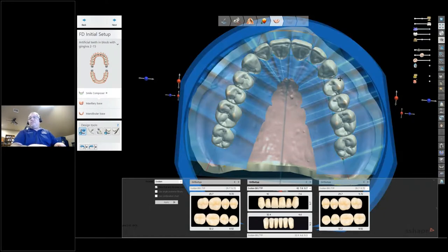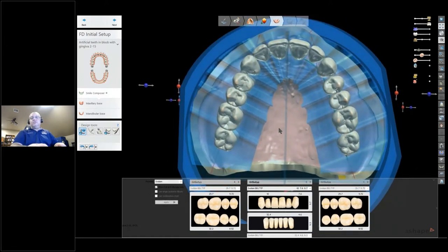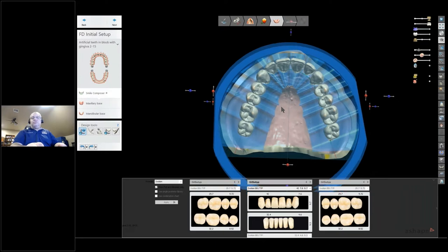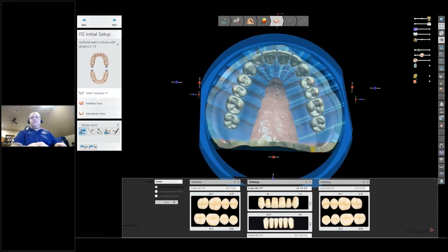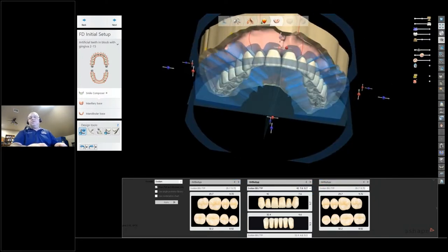If it was going to be poking out of that 98.5 millimeter disc size, this might be a time when I would think about maybe going to the two-piece oversize milling process, where I'm using a separate denture tooth and denture base, because I do have a little bit more usable space in that disc for the 98.5 millimeters. I also might consider at this point printing the base out of a flexible material and investing my dentures. That way I could still fit that great big arch of the denture base into a denture. So it is something I think about as well. But this one is going to fit just fine.